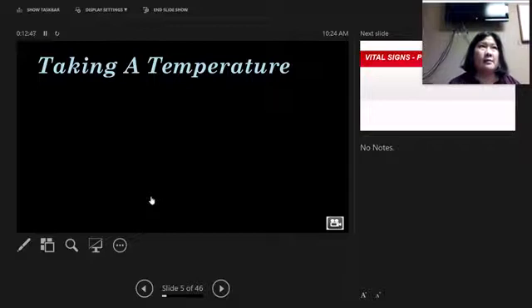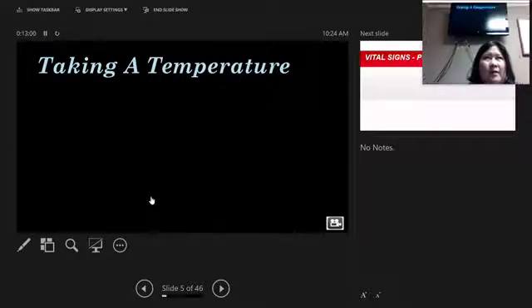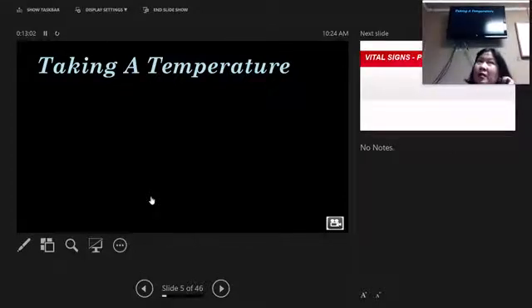It also says for children less than 2, pull down on their ear. And then there was one more thing that's kind of different in the video. I can't think of it right now. Down and back for the infant, but pull up and back for adults. Now, that's the same thing when you're putting in a hearing aid. So when you're helping them put their hearing aid in, you pull up and stick their hearing aid in. You pull down to get the hearing aid out.